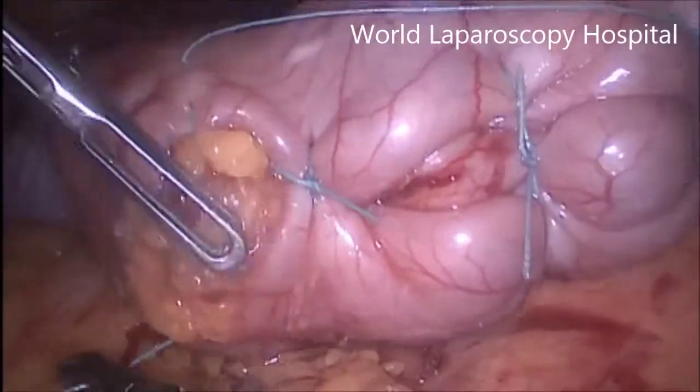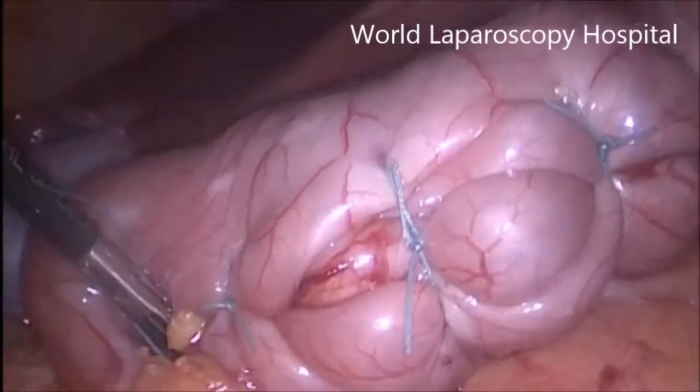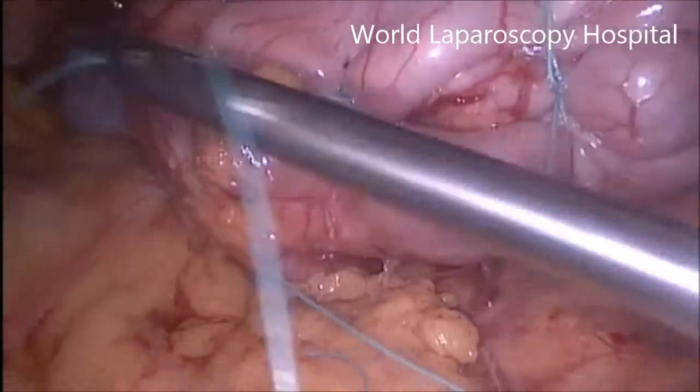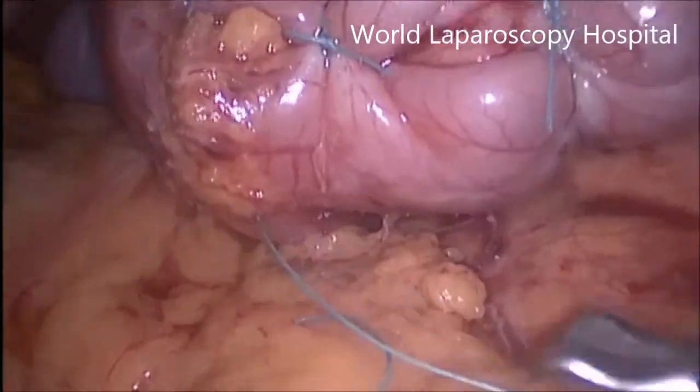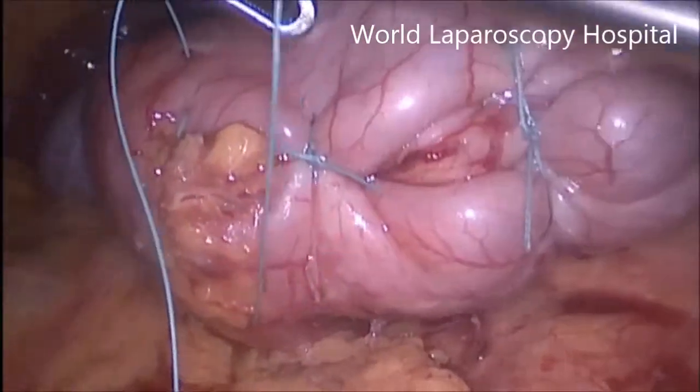Now this is the last part near the antrum, the last part, four centimeters away, and that also is plicated.